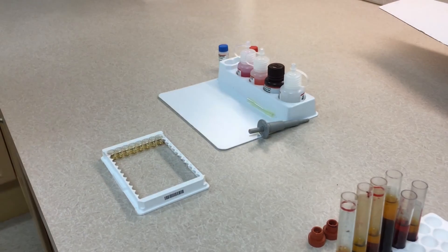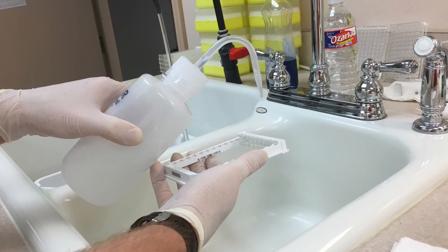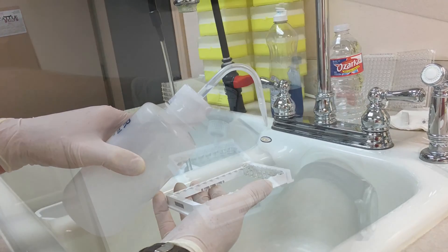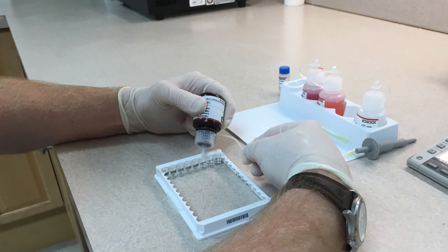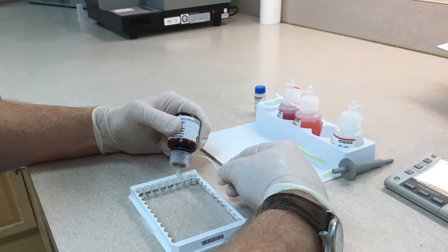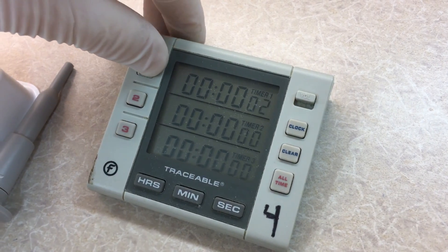We'll skip through this part of the video — after the seven minutes you'll wash it again just as before, and then put in your TMB reagent just like the other reagents and let it sit for seven minutes once again.